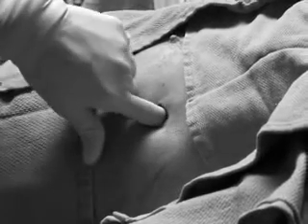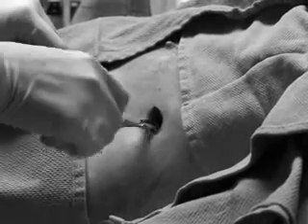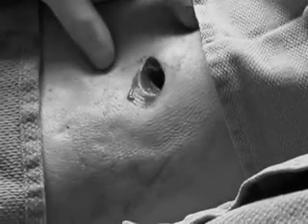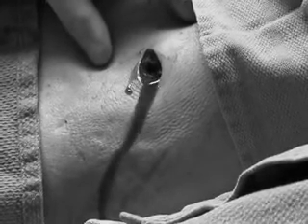Once you have dissected through the subcutaneous tissues and deeper intercostal muscle layers, you will encounter the parietal pleura. Push the clamp gently through the parietal pleura. The entry into the pleural space through the parietal pleura is felt as a give, or a sudden release of resistance. Alternatively, you may use your finger to penetrate through to the pleural space. Once the pleural space is entered, use your index finger to ensure the lung is not adherent to the chest wall, which may impede passage of the tube into the pleural space. Often, pleural fluid will trickle out through the tract, further confirming entry into the pleural space.